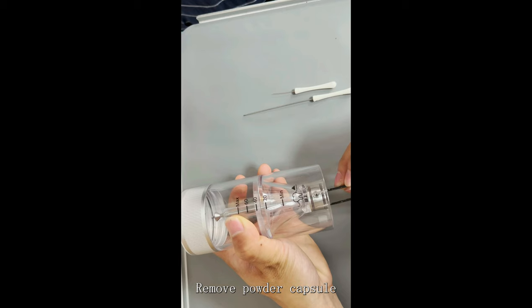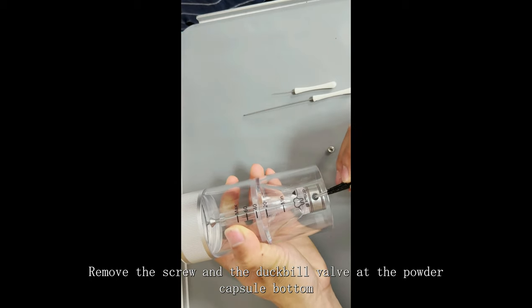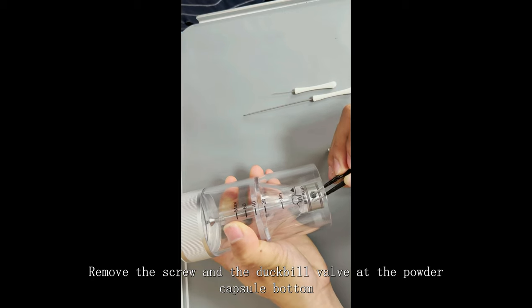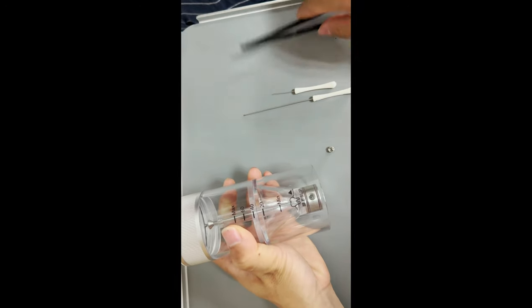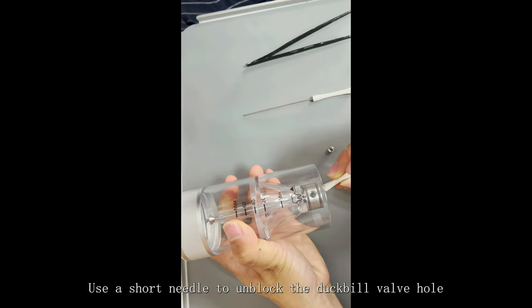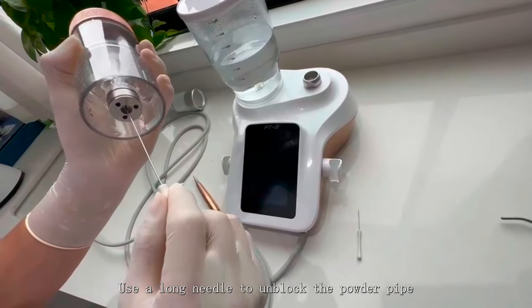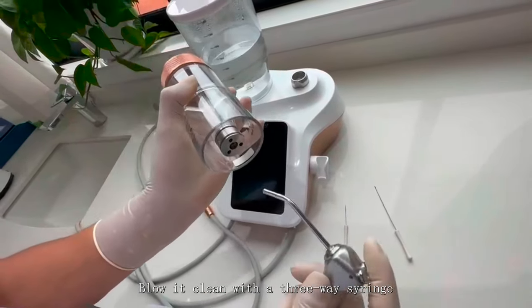Remove the powder capsule. Remove the screw and duck-bill valve at the powder capsule bottom. Use a short needle to unblock the duck-bill valve hole. Use a long needle to unblock the powder pipe. Blow it clean with a three-way syringe.